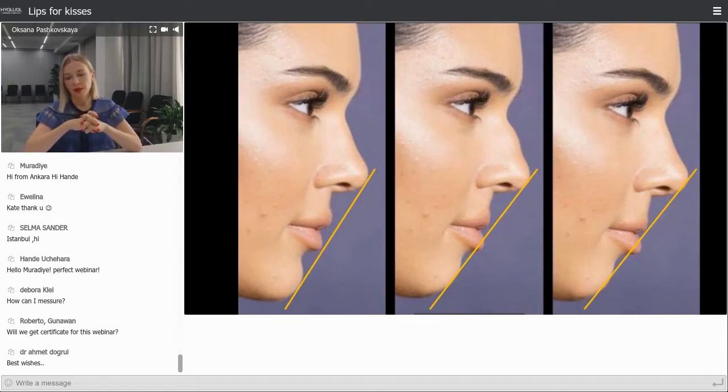Look please, and really it's what I mentioned before: when a young girl comes and asks to inject her lips, we pay attention to her profile and see this situation or another situation. Of course, first we should take a photo and try to explain to her that first she really should harmonize her profile, because full lips would not be attractive on her, would not fit her face until her profile has been corrected.